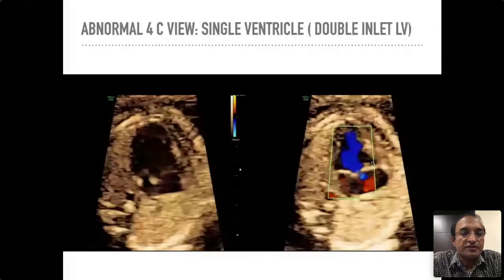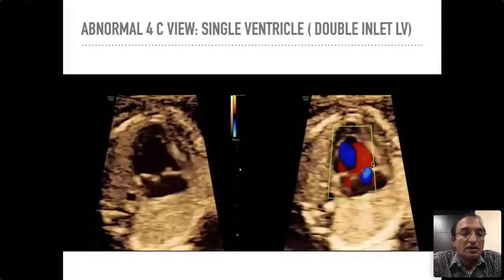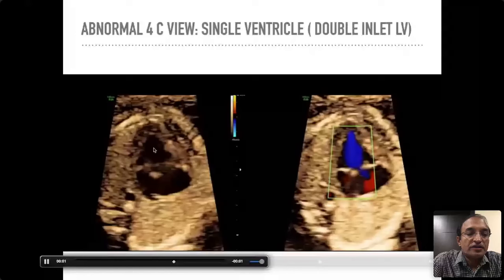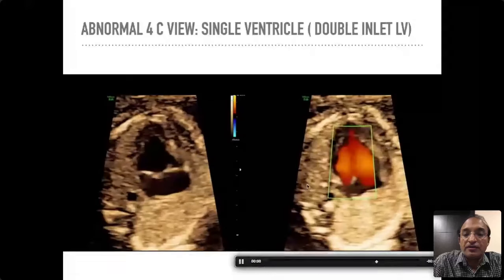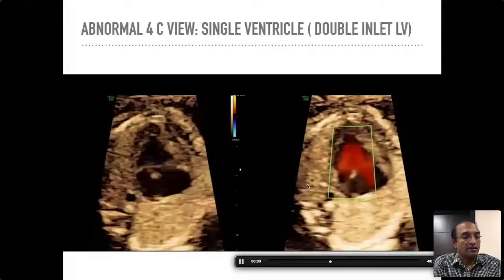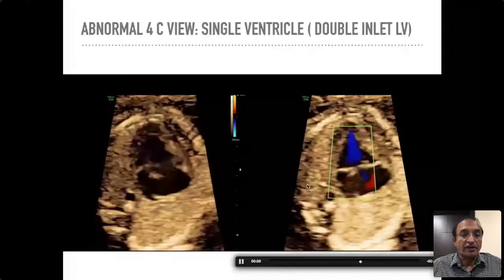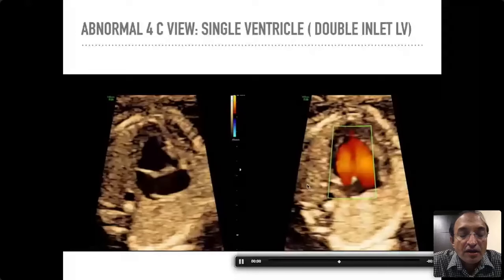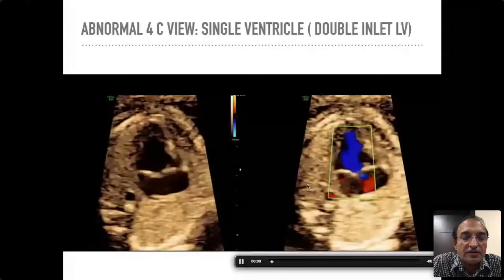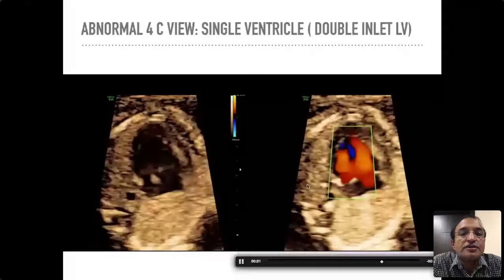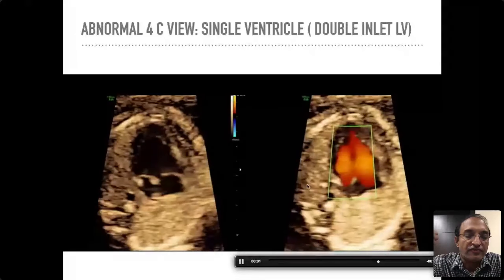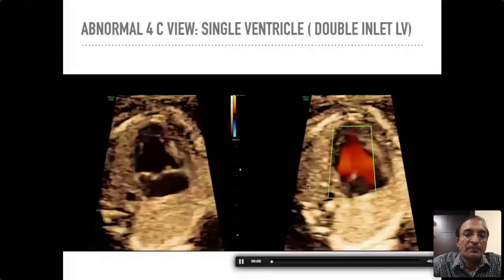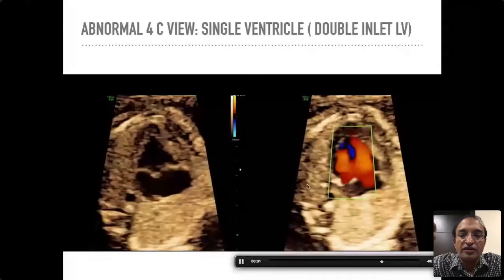Here is one more condition shown in the four-chamber view with color. You see two atria and just one single ventricle — both valves are opening into the same ventricle. This is another type of single ventricle called the double inlet type, which is a common form. So, the different types of single ventricle covered include HLHS, pulmonary atresia with intact septum and hypoplastic RV, tricuspid atresia, and double inlet left ventricle. The double inlet LV and tricuspid atresia tend to have the best prognosis because in both cases the main ventricle is the left ventricle, whereas in hypoplastic left heart the main ventricle is the right ventricle — which is acceptable in utero but after birth we want the left ventricle, as it is the stronger ventricle.